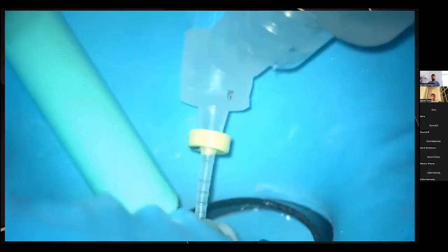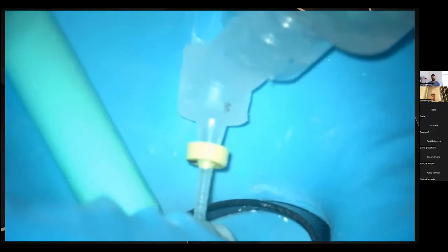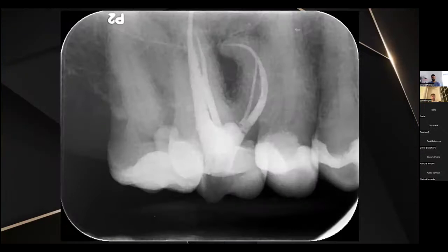Whereas when you compare that to the Irriflex in the MB canal, you see the depth markings there. That top one is 22 mils. My stopper is at 23 mils, and we're getting all the way to the apex. So we're delivering that irrigant to the apex, and in almost all cases, it will make a very big difference. And then that was the post-op up here. With your metal needle, I did actually bend that needle a little bit, and you're really only getting maybe up to here. You're not getting very far.